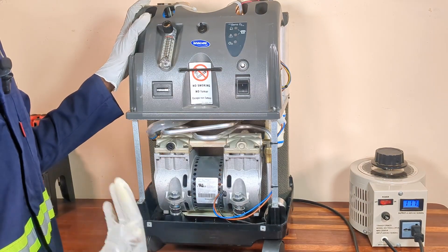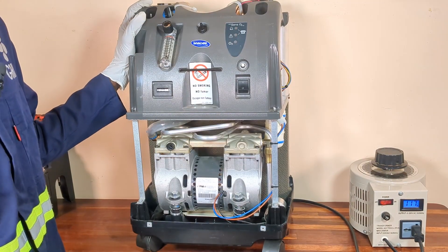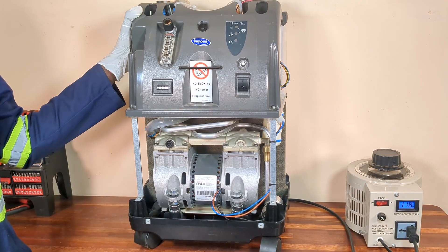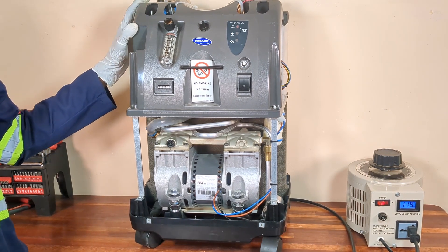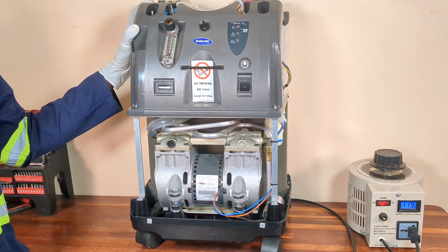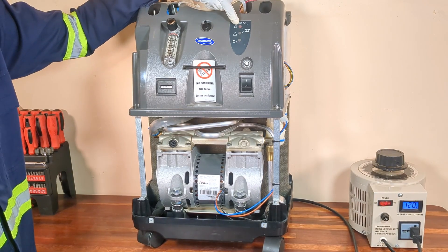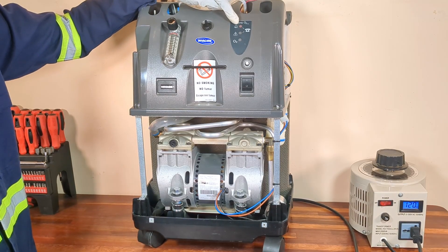Now I will turn on the oxygen concentrator. As you can hear, a continuous output alarm has been activated. This is because no compressed air is being sent from the compressor to the sieve beds for oxygen generation. The continuous output alarm is also accompanied by a LED service indicator light. This is because the system is detecting oxygen purity below 73 percent.